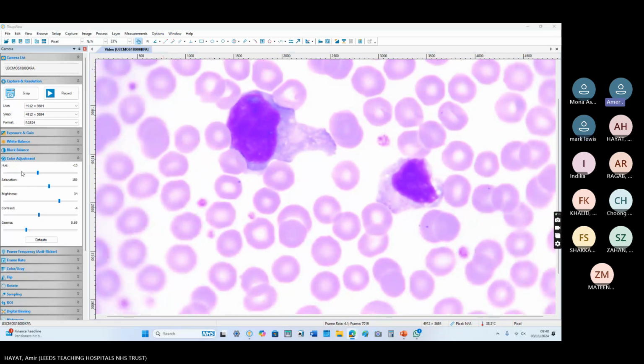So I think this is the typical picture in front of you now. I should not move from this picture. This is a common FRC path question, appeared twice in the morphology cases in the last 3 exams. So we have mentioned previously, look at the patient's age and the symptoms. This may give you some help in the diagnosis.